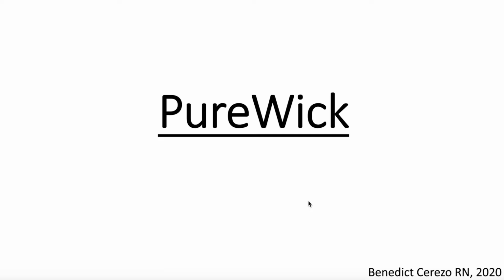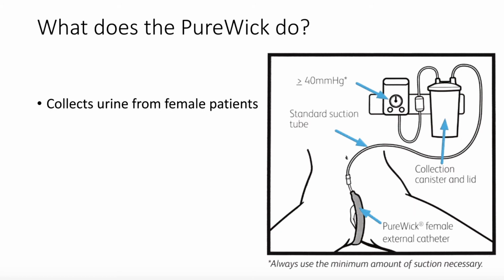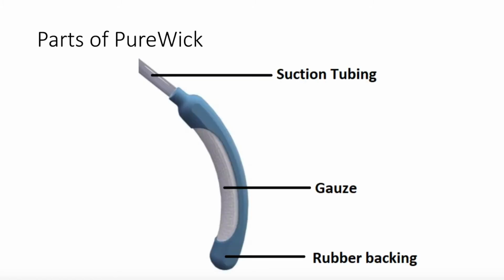So let's talk about the PureWick. So what does the PureWick do? Essentially, it collects urine from female patients using suction. These are the parts of the PureWick.